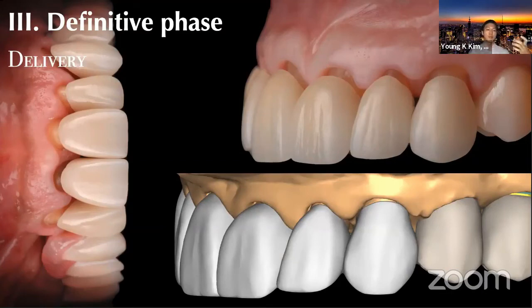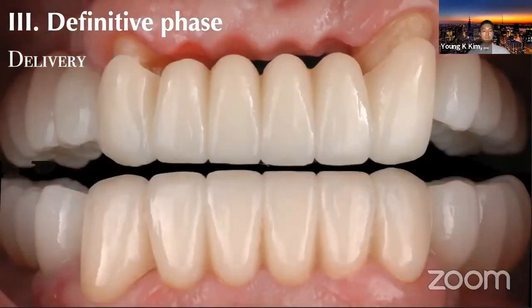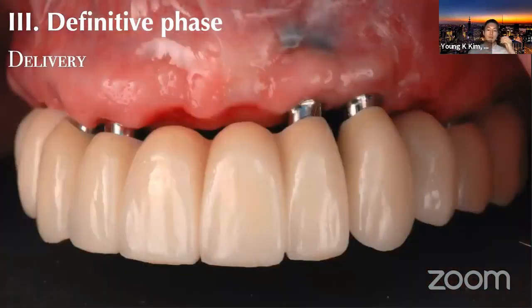And the monolithic technology has been improving every day. The ovate pontic sites are well developed in this case with a bridge with proper provisionalization and polished surfaces. And the desmosomes of the epithelial tissue will adhere to the polished surfaces. That's why I prefer to use ovate pontic sites in any of those edentulous prosthetic regions. If you're using custom abutments, which I think is perfectly fine, with a pre-cementation technique, you can predictably utilize the cement-retained implant process, and you can control the excess cement and clean it well.